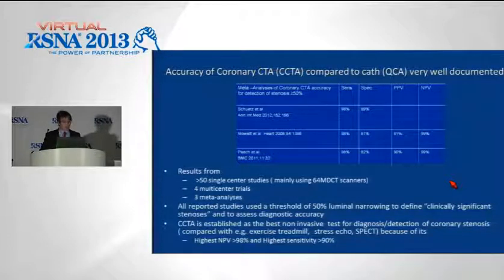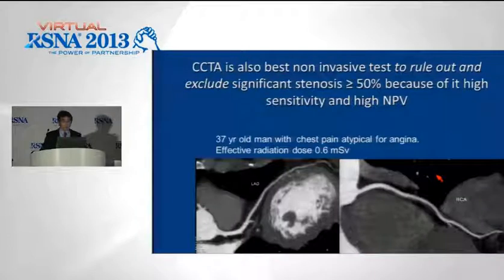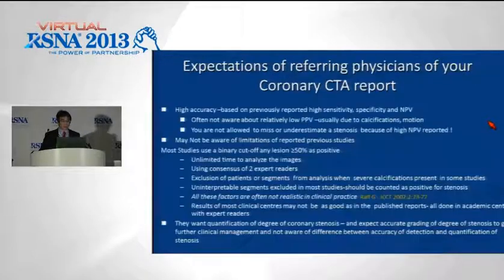because of its, as you all know, high negative predictive value, and it has the highest sensitivity of all the non-invasive tests. It's also the best non-invasive test to rule out and exclude significant stenosis of more than 50% because of this high sensitivity and high negative predictive value.